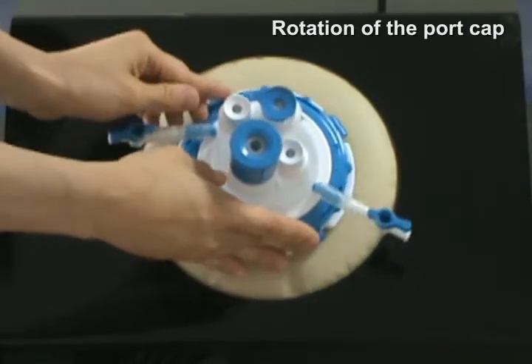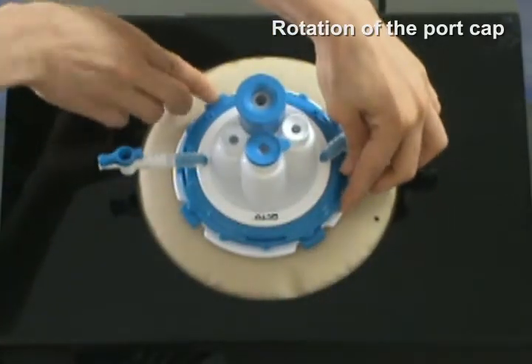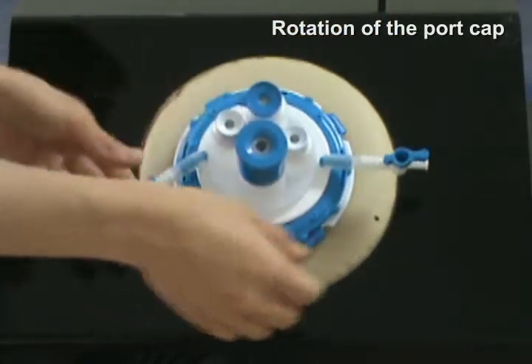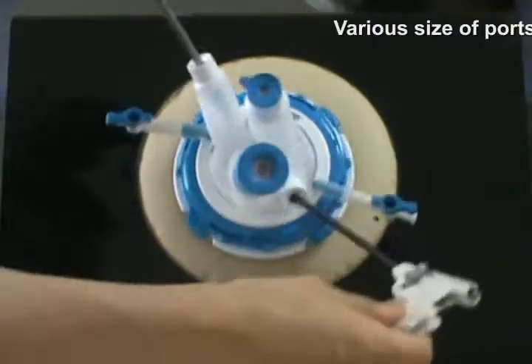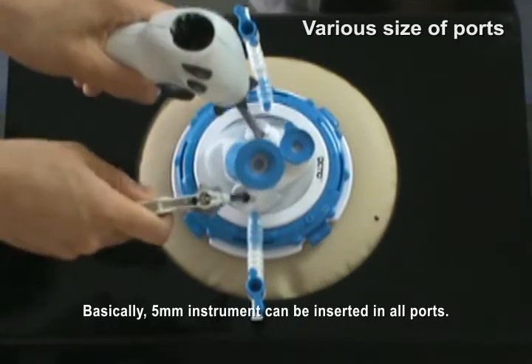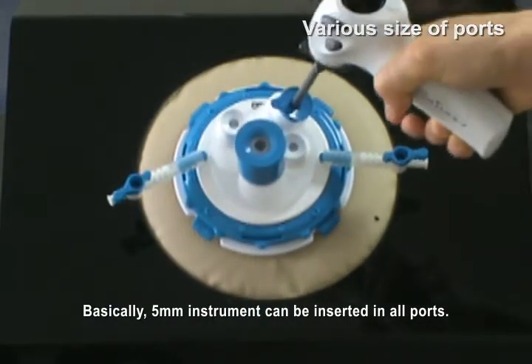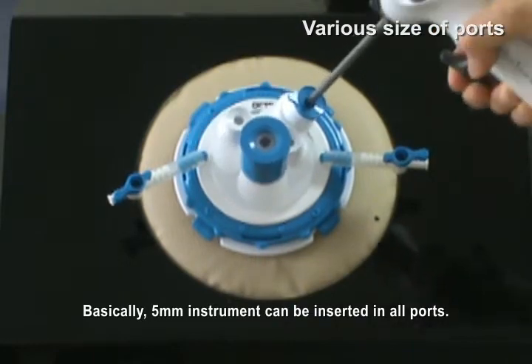This port cap can be rotated 360 degrees for the surgeon's preference during surgery. There are four ports and their sizes are made to insert the appropriate size of instruments. 5mm instruments can be easily inserted into all ports.